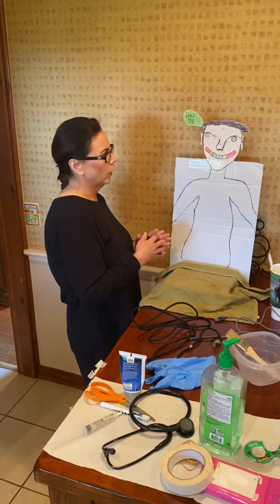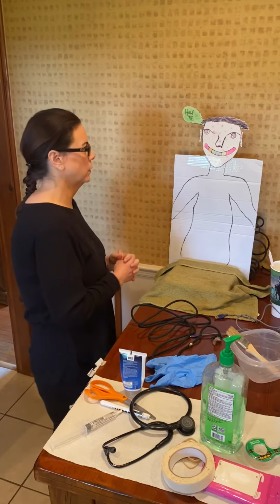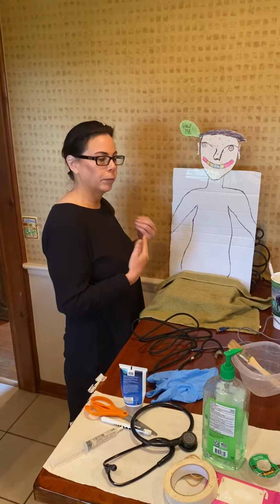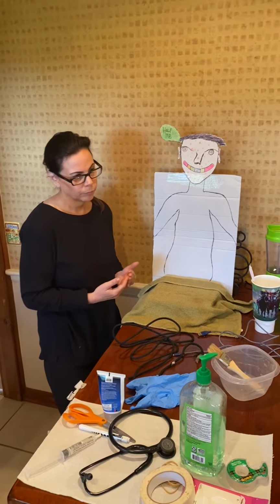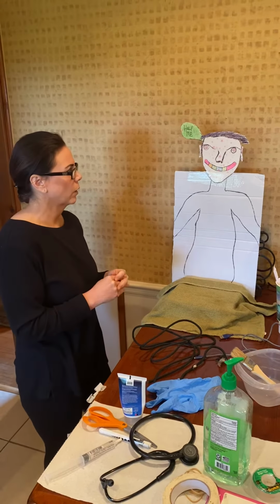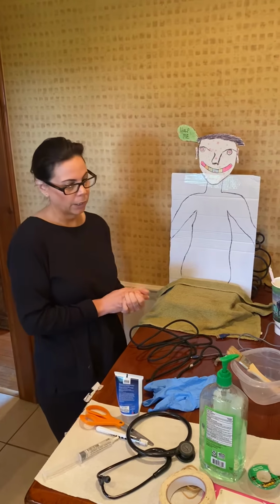First thing I'm going to do is verify the order. So this order has been verified by the doctor to give this patient an NG tube. I'm going to provide privacy, wash my hands, and introduce myself to the client.